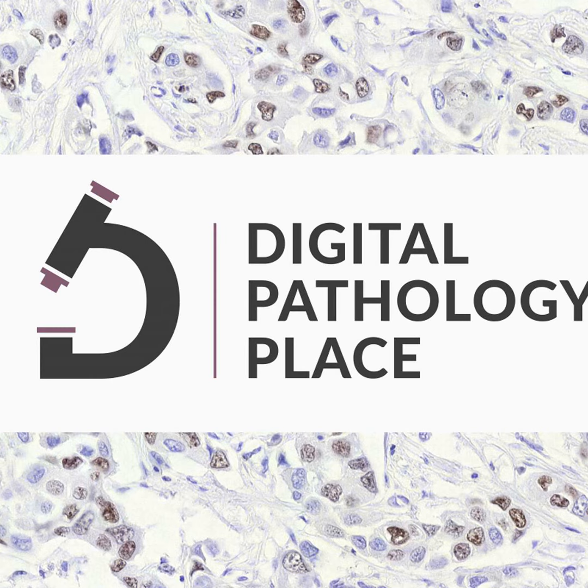However, a comprehensive comparison of these measures had never been performed. So they had 1,412 cases from Boston University brain banks, and human-driven semi-quantitative scoring was compared with computer-driven percentage area stained measures and AI-driven cellular density quantification of tau pathology in the lateral frontal cortex.